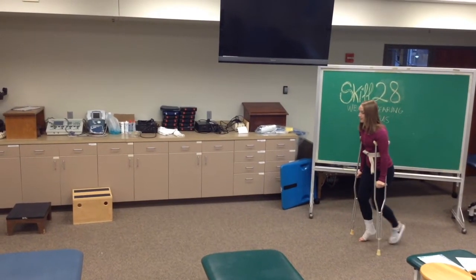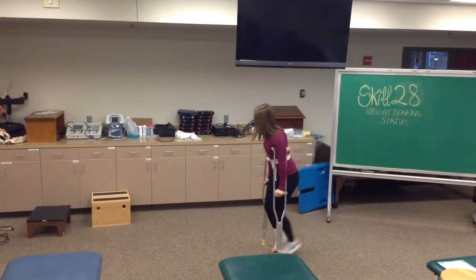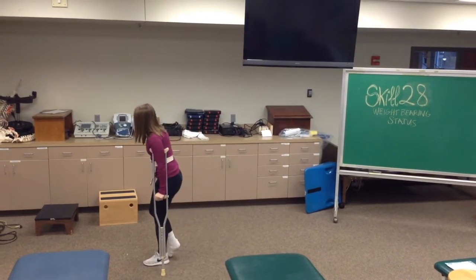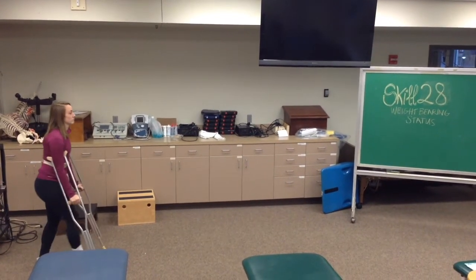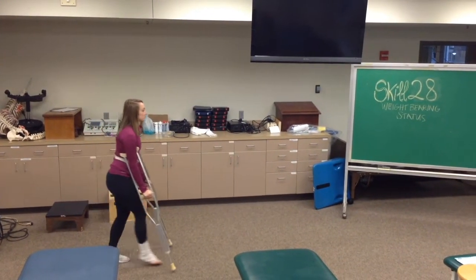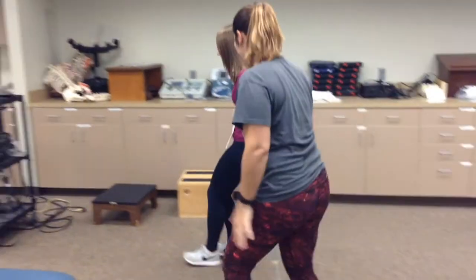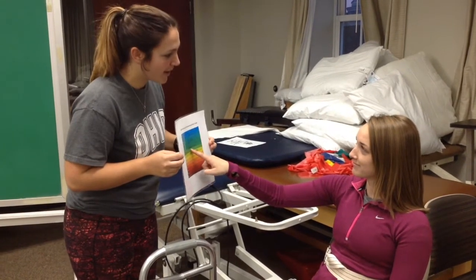Initial gait training should occur in a distraction-free environment on level surfaces. Training requires focused concentration to learn the gait pattern properly. A patient may require visual input of foot and assistive devices with respect to the body position. Ensure safety by keeping the area clear from obstacles and distractions. Frequent rest periods may be necessary if a patient feels fatigued. Monitor vital signs and rate of perceived exertion.